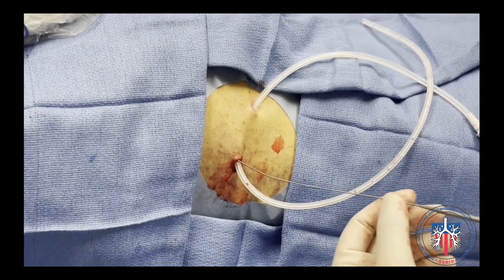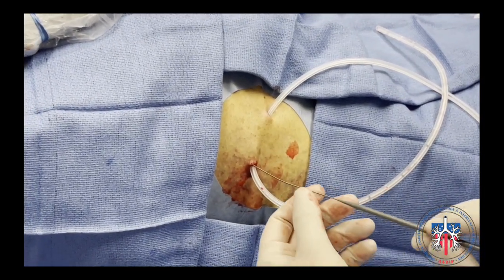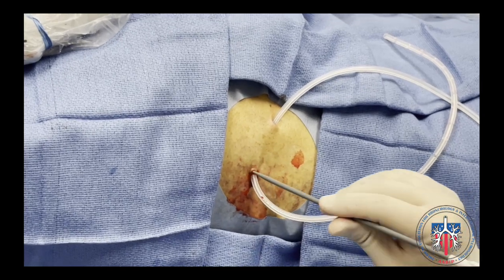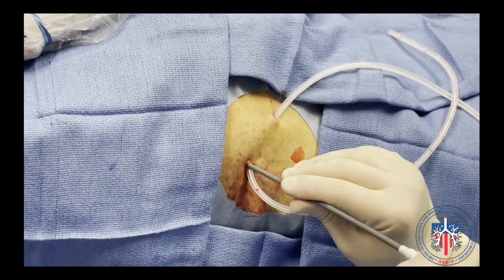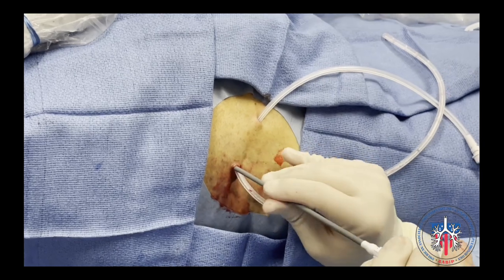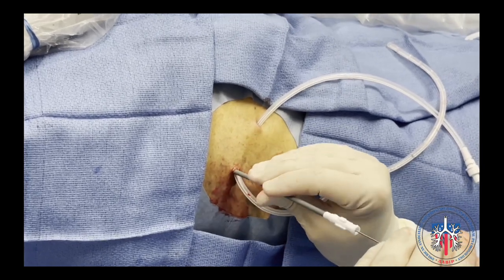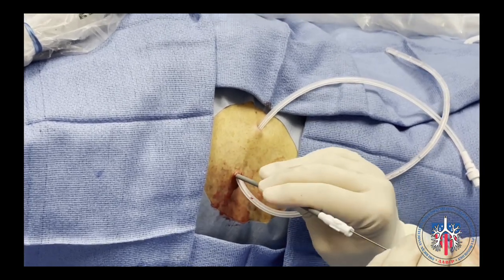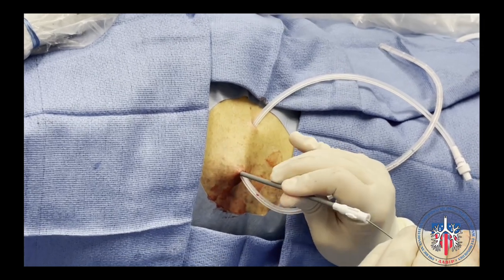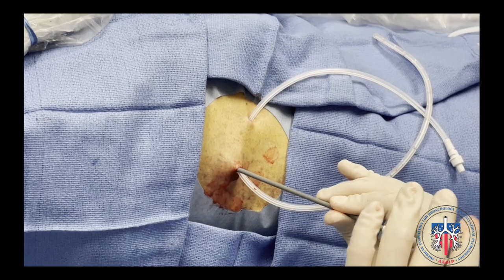Next, the dilator is inserted over the guide wire, positioned coaxially with the guide wire, and advanced into the pleural space. There is no need to advance the dilator the entire way into the pleural space. The dilator is then removed, leaving the guide wire in place.